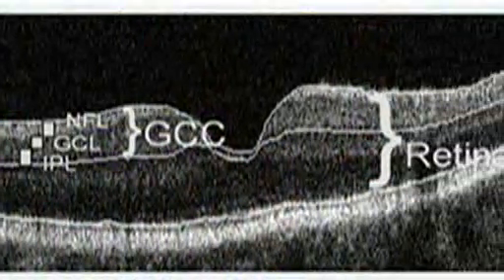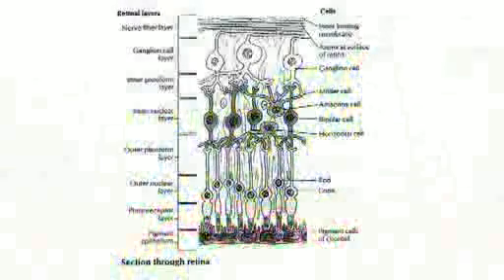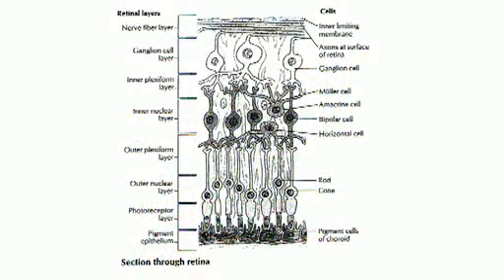So the OCT used for the retina is a fantastic tool to look for wellness of the back of the eye. We can see things that we simply couldn't see before. There are layers of the eyes that we knew were there, but basically you couldn't see them because they're kind of clear, and this allows us to separate those out. We are better at diagnosing disease and managing disease and treating disease than we ever were before.